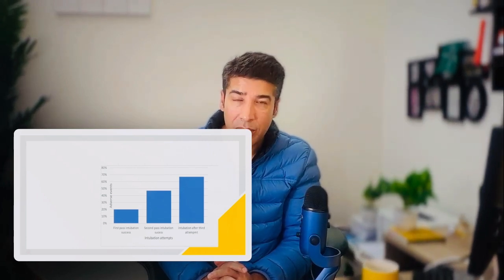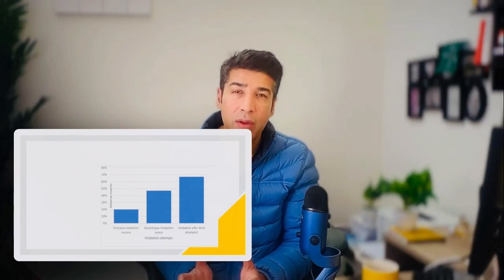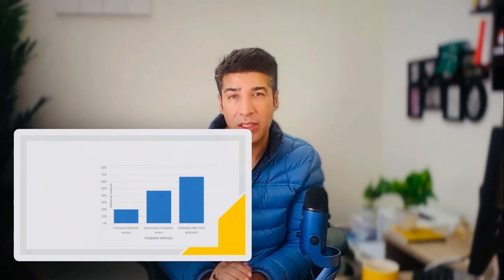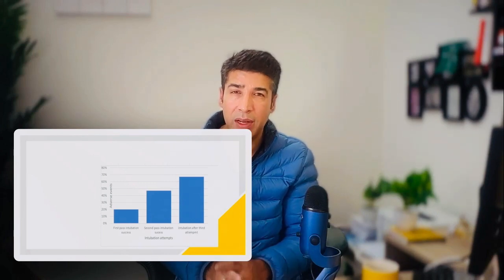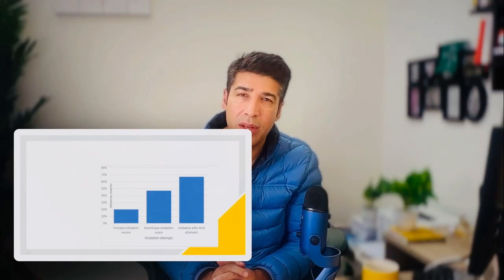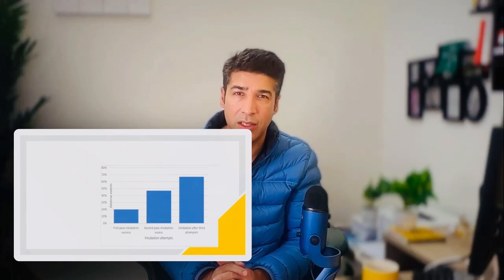There have also been studies that video laryngoscopy is better for first pass success than conventional laryngoscopy. So if you are expert and have the availability of a video laryngoscope, it's always better to go for video laryngoscopy rather than conventional laryngoscopy.